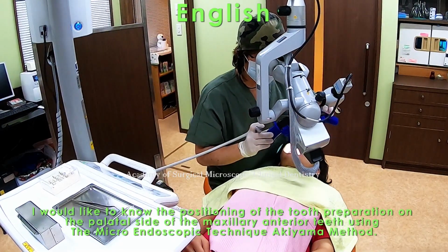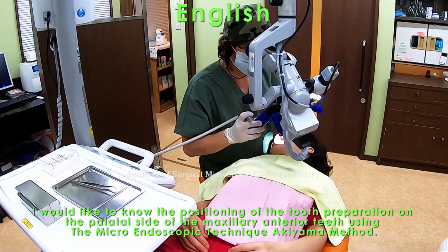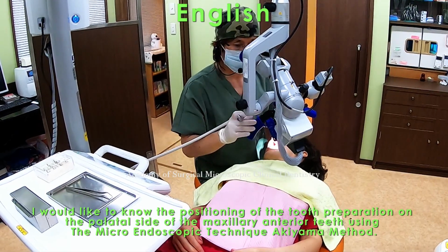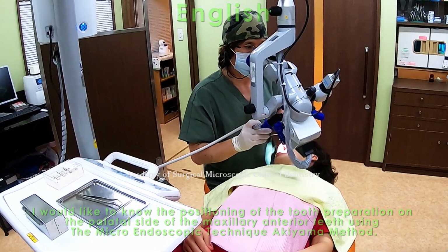I would like to know the positioning of the tooth preparation on the palatal side of the maxillary anterior teeth using the microendoscopic technique AKIYAMA method.